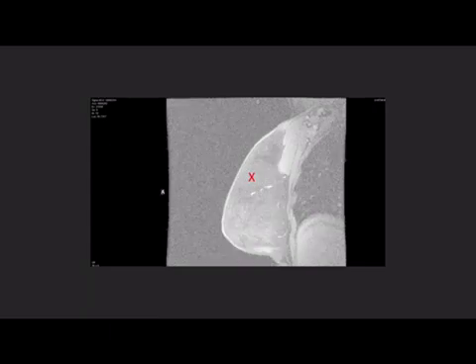Here we are, scrolling back, going toward the grid. You can see I've got a cursor there left at B on the lesion. Usually once we get the grid, we've got about three different slices that we see the grid on. I take the middle of those slices.